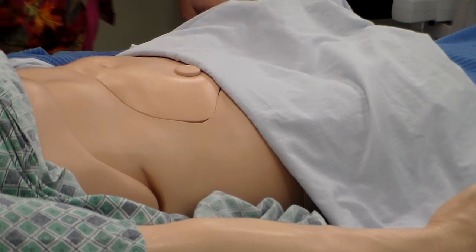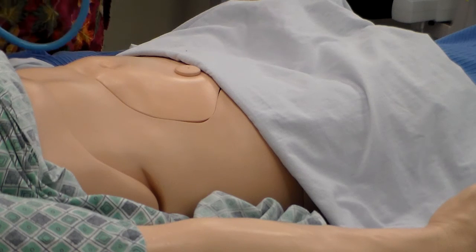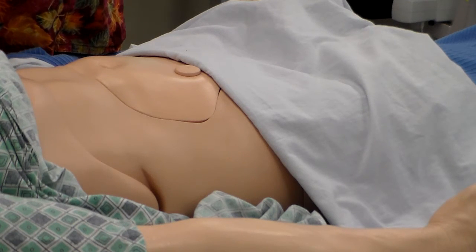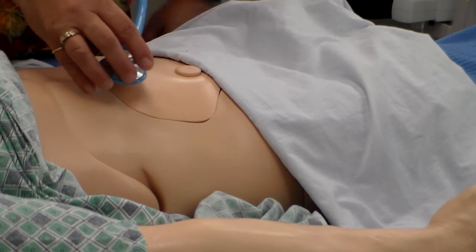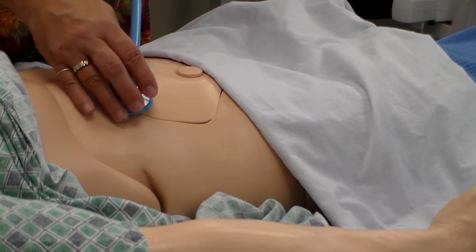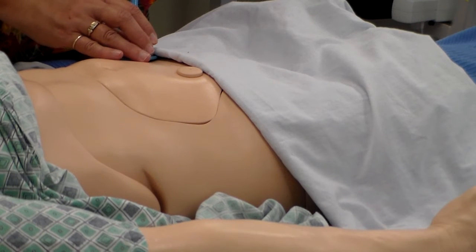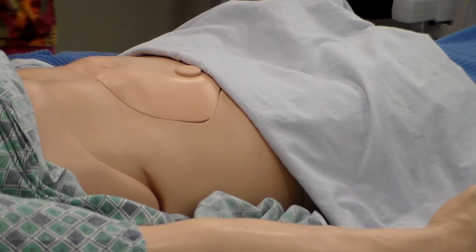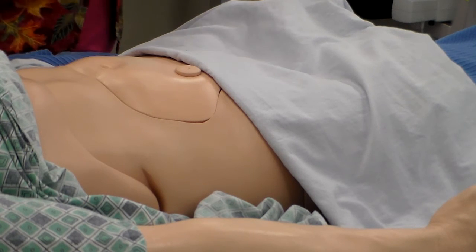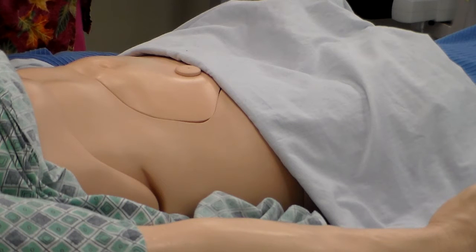The next, we're going to auscultate the abdomen for bowel sounds. Auscultate means to listen, right? So we're going to put our stethoscope in our ears, and we're going to auscultate the 4 quadrants, okay? 1, 2, 3, 4. How long are we going to auscultate? Well, we're going to auscultate each section until we hear something, or 1 minute, okay? At 1 minute, basically, there are no bowel sounds, okay?